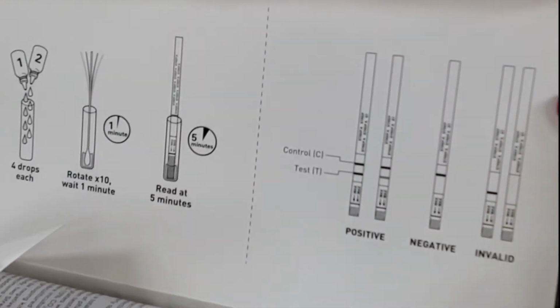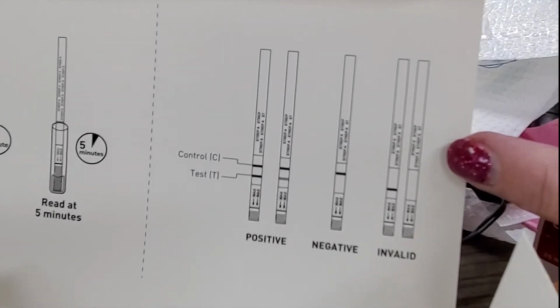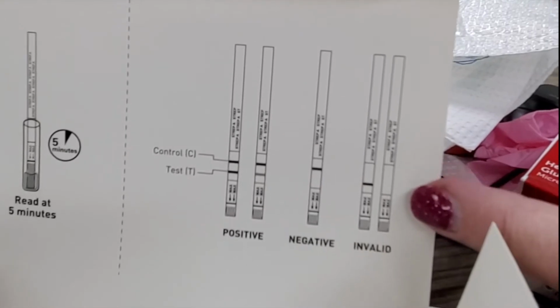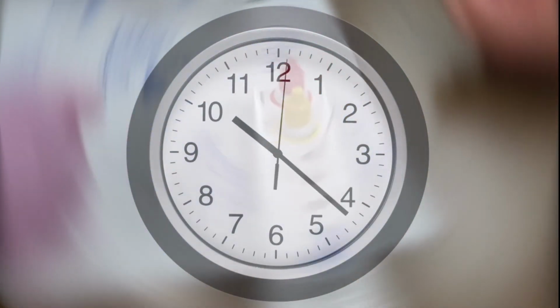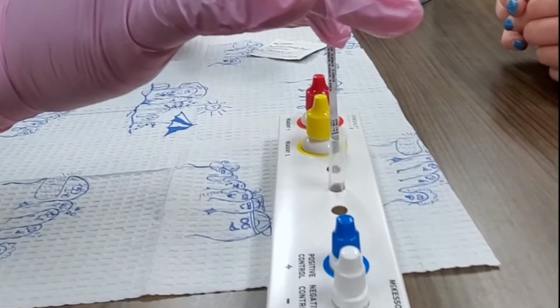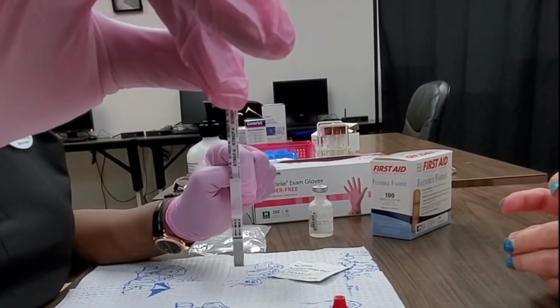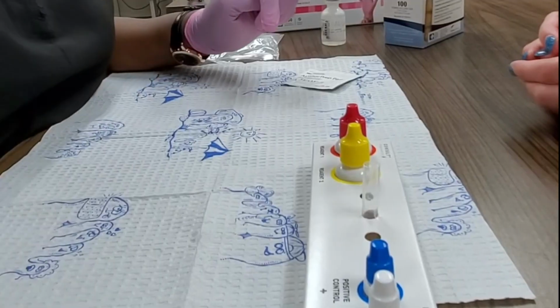And as indicated earlier, it would show the same 2 lines for positive, 1 line for negative towards the top, and if it were towards the bottom, the 1 line would make it invalid. Okay, we've waited 5 minutes now. Let's see what the results are. If we have 1 line or 2, we just have 1 line, it's negative.